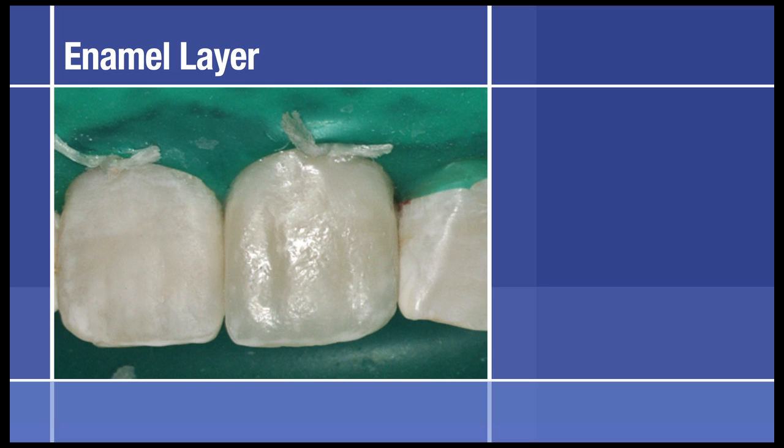We certainly don't want to remove all the characterization that we placed with the finishing procedure. So all the thickness of these individual layers really needs to be accurate to minimize finishing procedures.